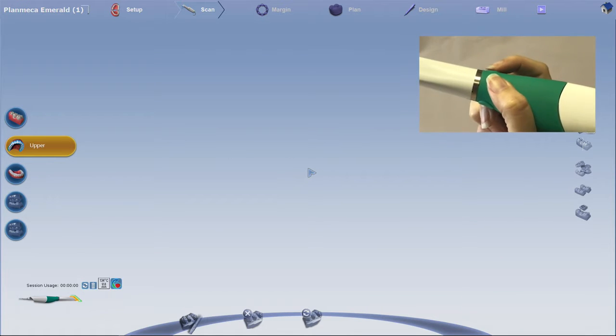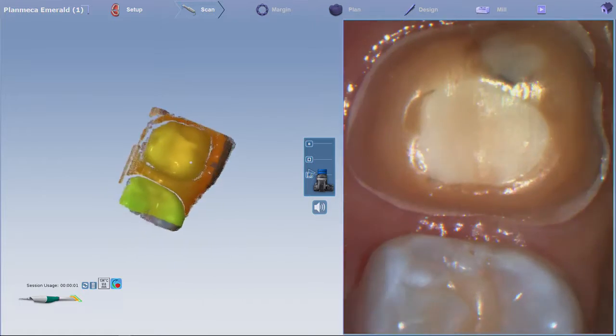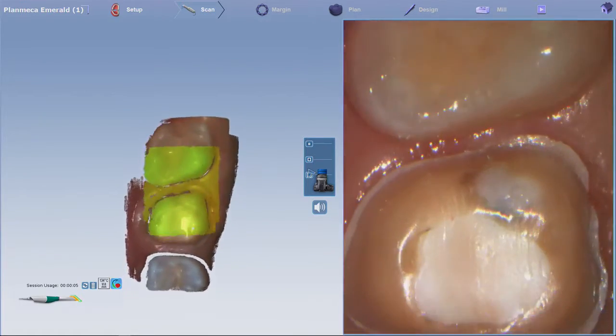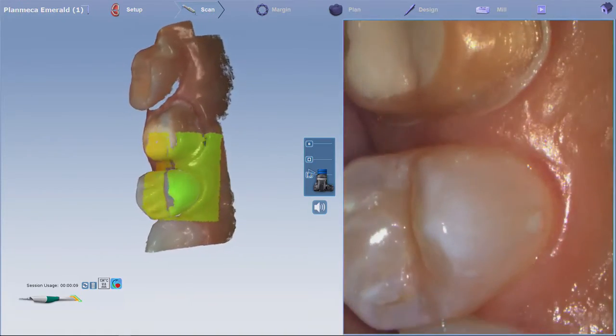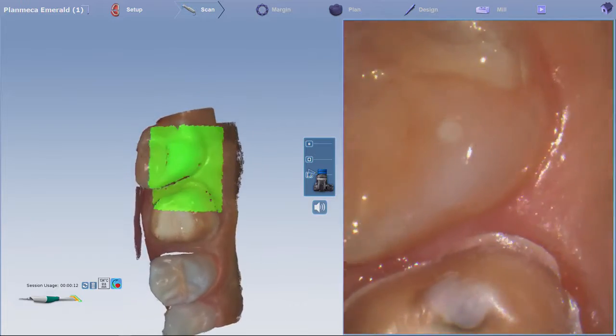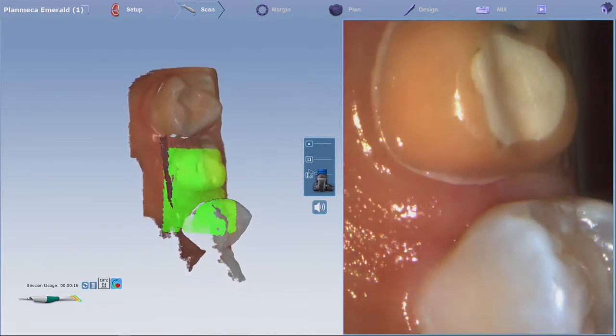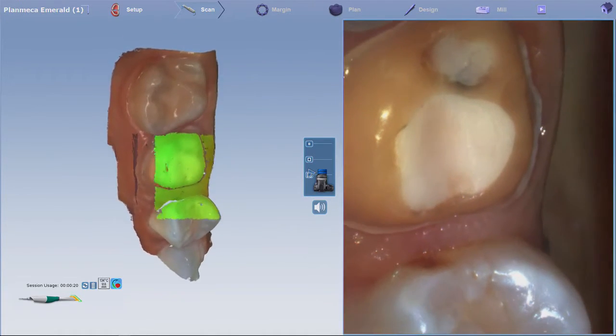Press the top button to activate the scanner. Because the scanner activates immediately, it'll be easier to start when it's in position in the mouth. Scan the preparation, the opposing, and the bite as you normally would.